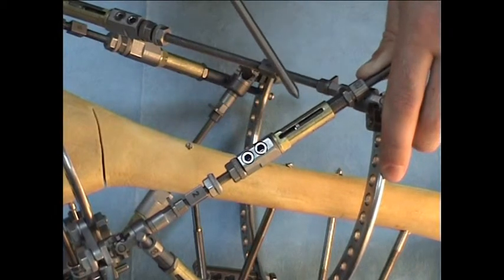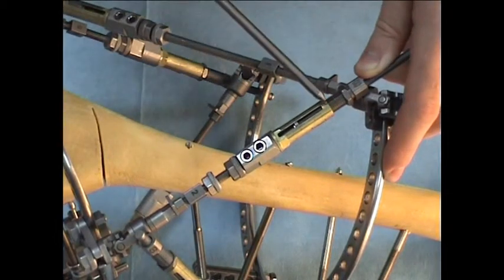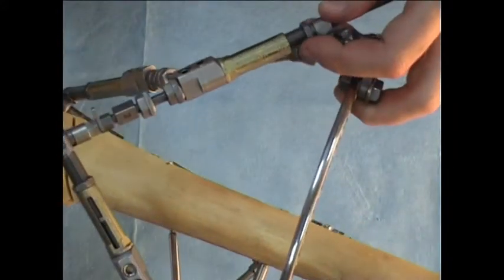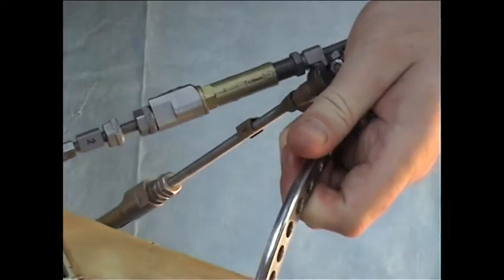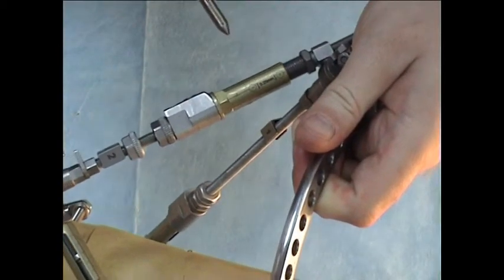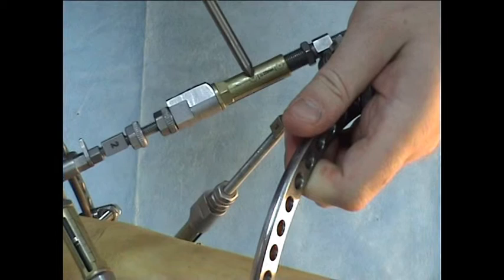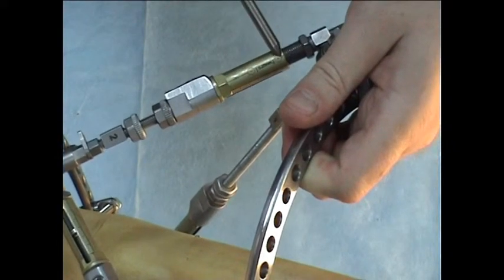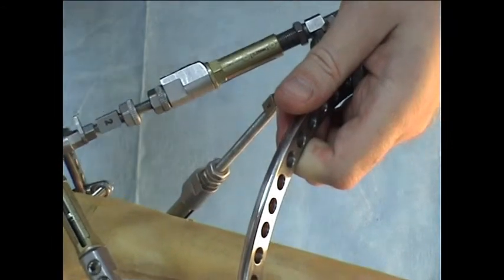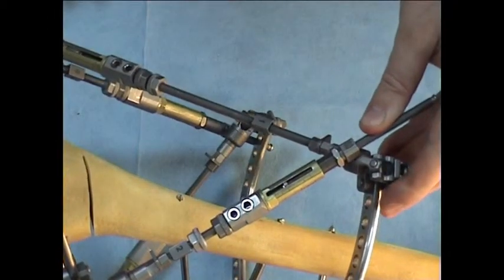On the threaded internal clutch of the strut there is a bold longitudinal line. On the yellow cylinder, as I told you, there are 8 longitudinal black lines. We have to turn the yellow cylinder twice from one black line to another. Also on the yellow cylinder there are arrows pointing in the plus and minus direction, so it is easily understandable where to turn the strut to make plus or minus. In this case we will do +2.